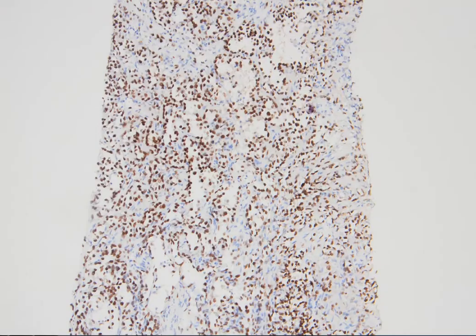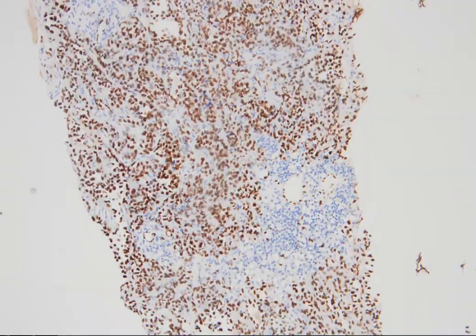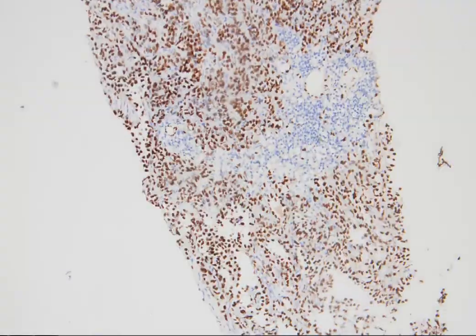ERG also has some weaknesses, as it is positive in some other tumors like epithelioid sarcoma, for example, and also in prostate adenocarcinomas. But both positivities strongly support the diagnosis of angiosarcoma metastasis.